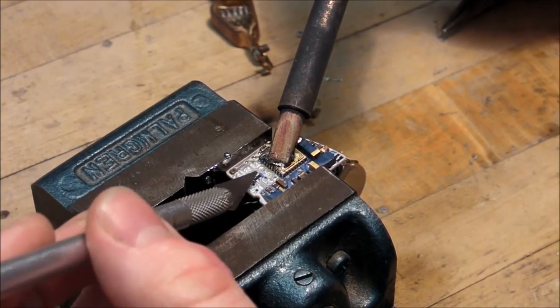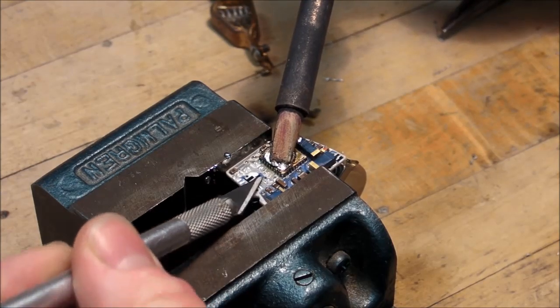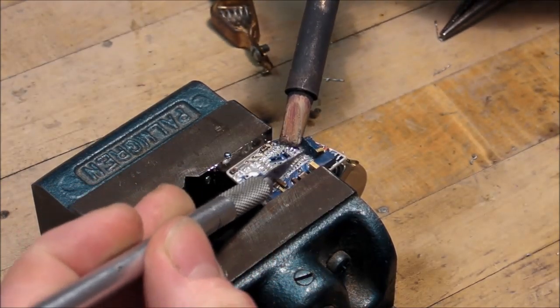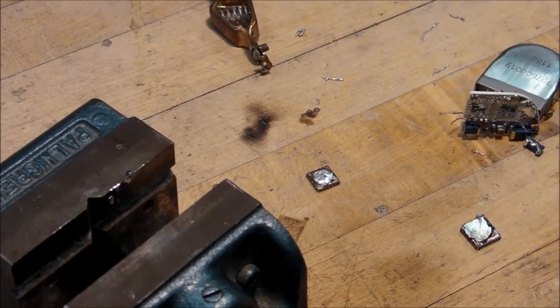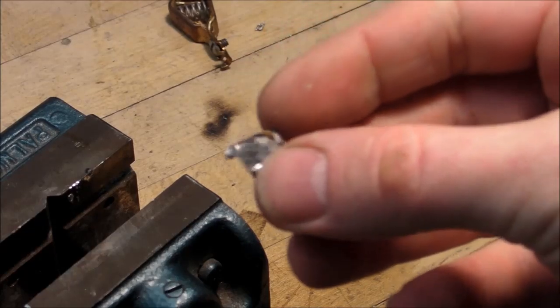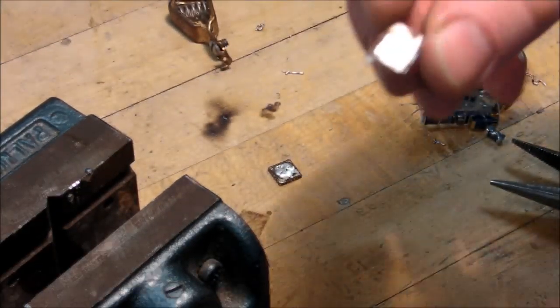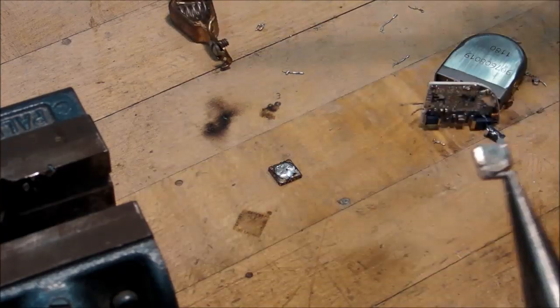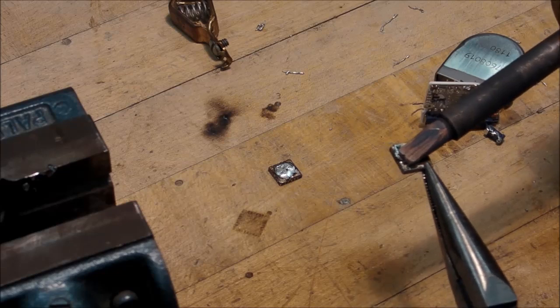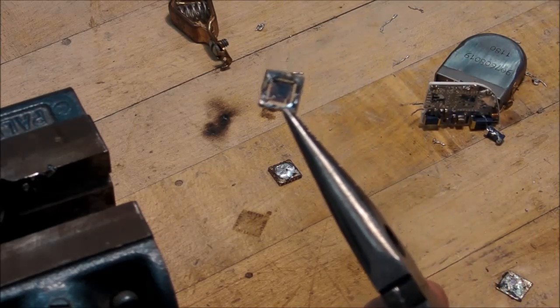Well, these chips are not popping open. All I can do is remove it from the board and expose some more carbon trace resistors on the bottom. This whole board's so hot, everything's falling off. Actually, I spoke too soon. It looks like this one, the square cover actually started to slide off a little bit, so just a little more effort. There we go. Now I got it. Let me do the other one real quick.